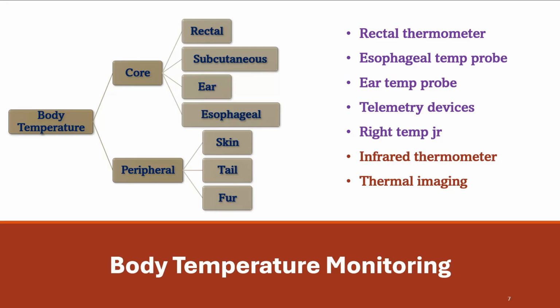For example, if the system records that the rectal temperature is above the set temperature of the animal, then the warming intensity will automatically be reduced to bring the animal to a stable preset temperature level. And that will work both ways, whether the temperature is lower or higher. So, this is the homeostatic, or homeothermic, mode of working, and this makes sure that the animal does not get underwarmed nor overwarmed.